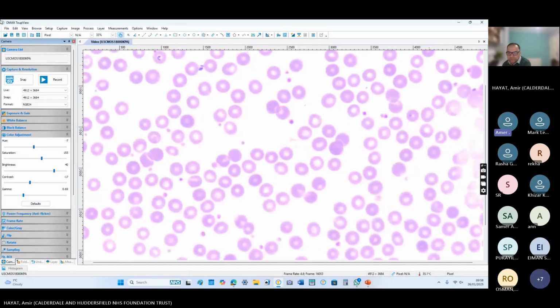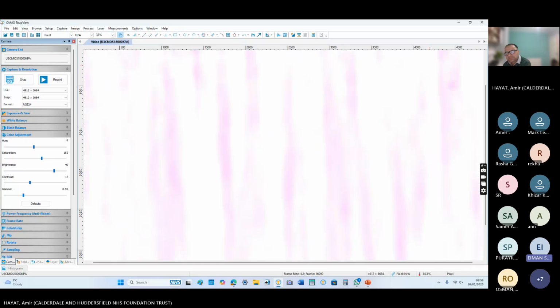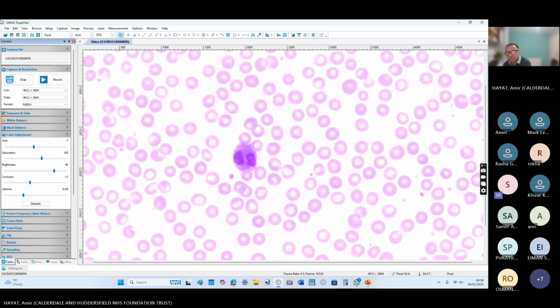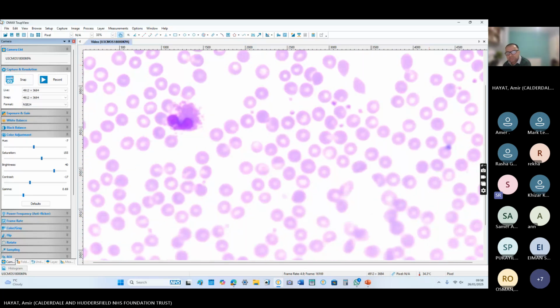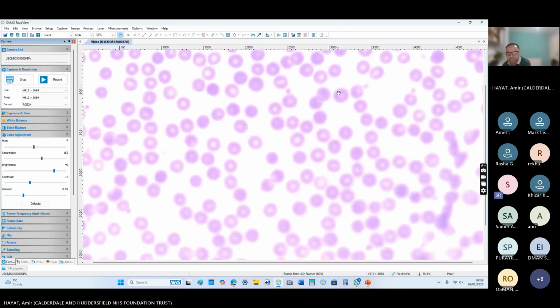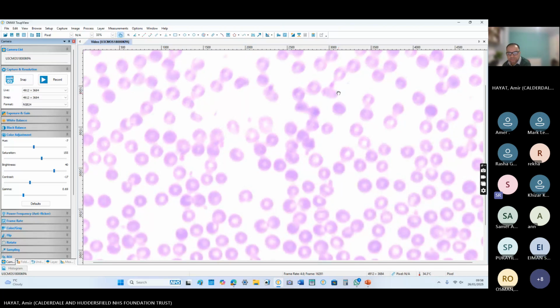So what are the clonal causes of eosinophilia? Chronic eosinophilic leukemia. Myeloid and lymphoid neoplasms with mutations like PDGFRA, PDGFRB, FGFR1, and acute myeloid leukemia, especially inversion 16, and acute lymphoblastic leukemia with translocation 5;14, but there the eosinophilia is secondary to a reactive cause, not due to the clone. And mastocytosis and other causes like CMML.